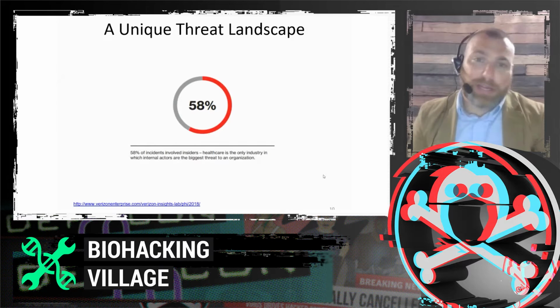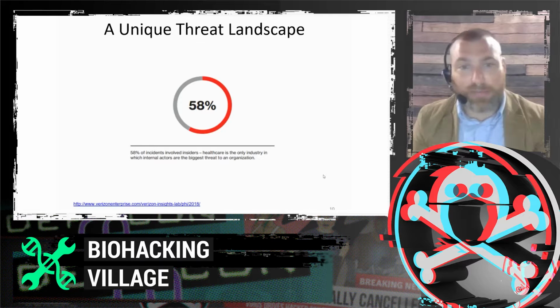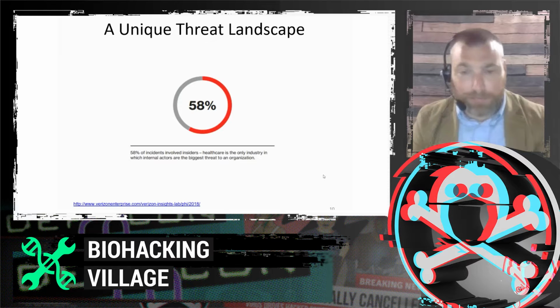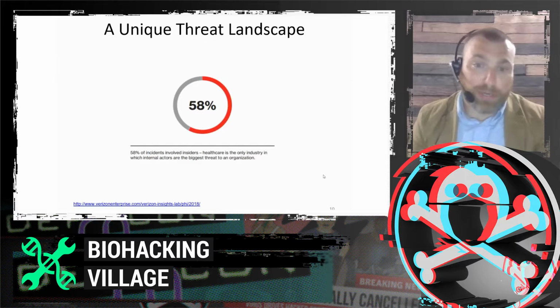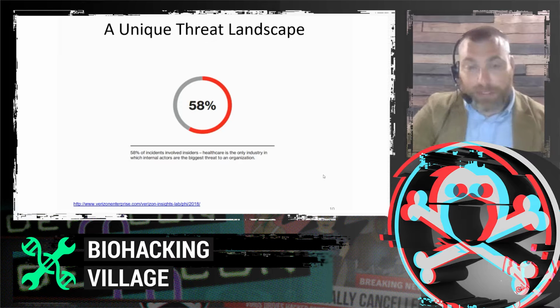One of the things that makes the threat landscape in healthcare really unique is the prevalence of insider threats. When we say insider threats, we typically think of malicious insider threats, but healthcare is unique in that there's a lot of error that factors into that as well. So non-malicious errors and data breaches as a result of that. In healthcare, 58% of data breaches over the course of those 3 years that were recorded did have some insider component. Again, both malicious and non-malicious, but that is important to note. It's the only critical infrastructure sector in the United States where you're actually more likely to be compromised internally than externally. So we want to make sure that we're taking that into account.